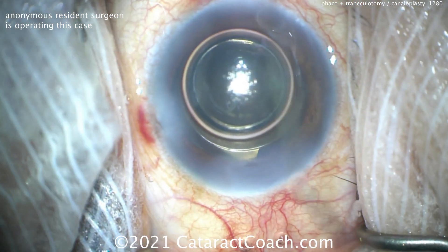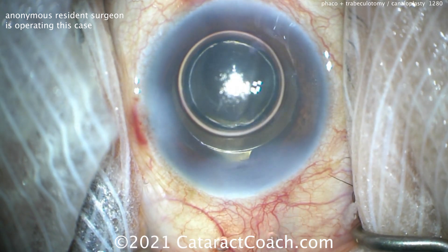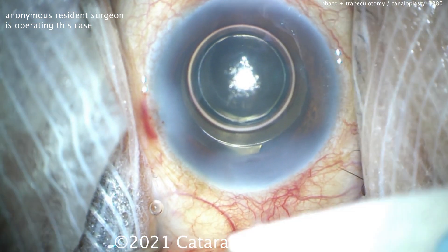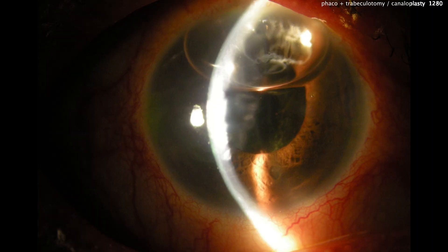Here at the end, everything looks good. You can check the incisions, check the firmness — make sure the eye has reasonable firmness, but again, not too much. And let me show you the post-op. The post-op period looks great — a little bit of corneal edema from the phaco surgery and all the manipulation, but that's okay, that'll resolve. You can see there's a nice looking air bubble up top still; that'll resolve in a few more days. This patient had a very nice control of pressure: post-op day one the pressure was about 19, and when the patient came back at post-op week one the pressure was 11 — and everything looked great. The eye was nice and quiet and looked beautiful.